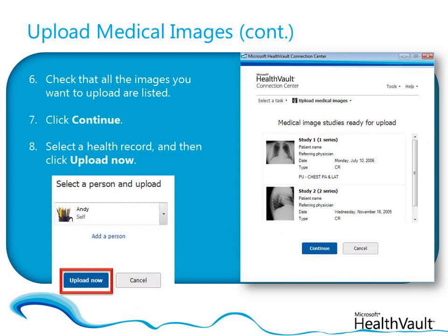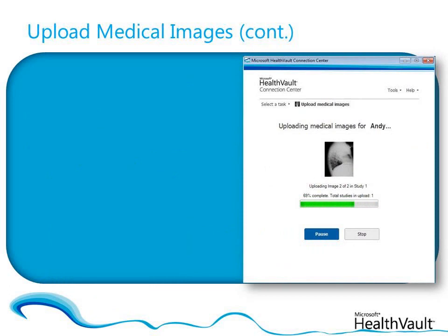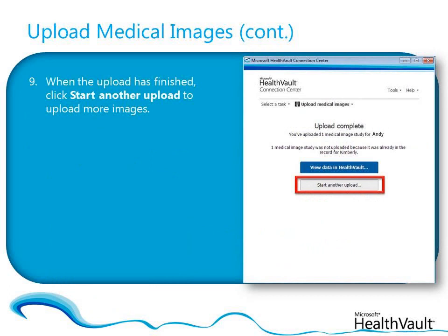Depending on the size of the image files and the speed of your network connection, the images may take a few minutes to upload. When the uploading is complete, if you have more images to upload, click Start Another Upload and repeat the process.